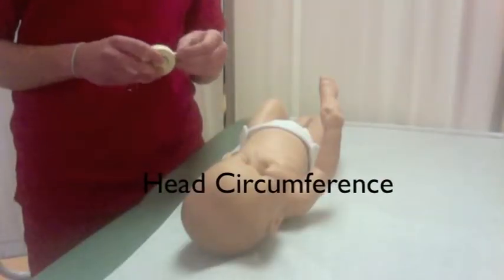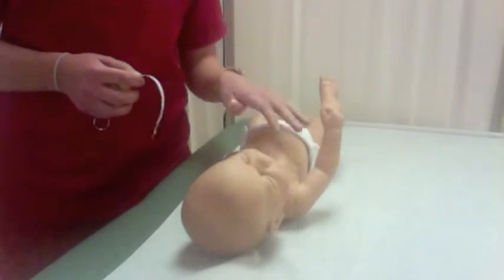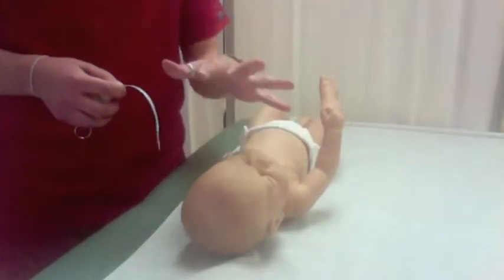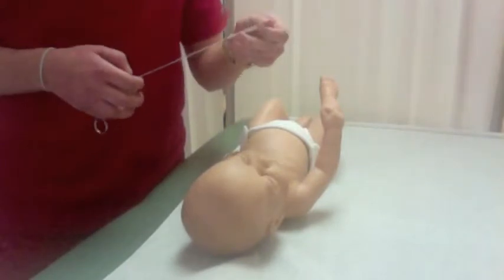Okay. Now we're going to do the head circumference. And you're going to use the centimeter side, unlike the length where we use inches. And the reason that we do head circumference in babies instead of adults is because the baby's head is growing so much more rapidly as they're younger. So this is why we measure it.